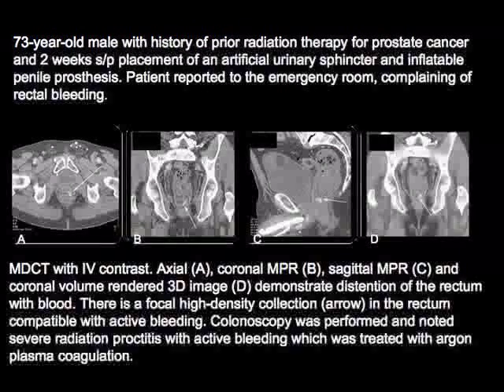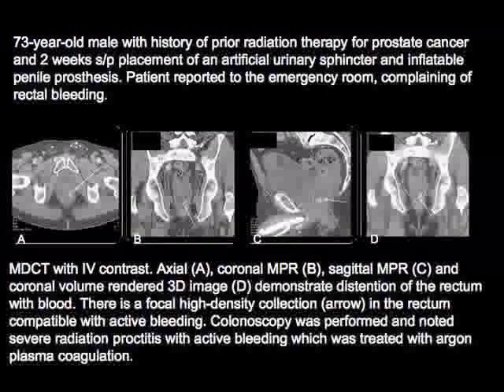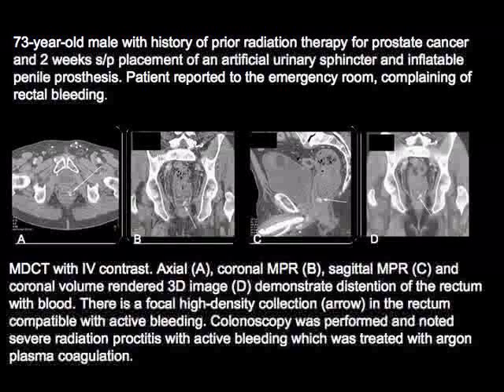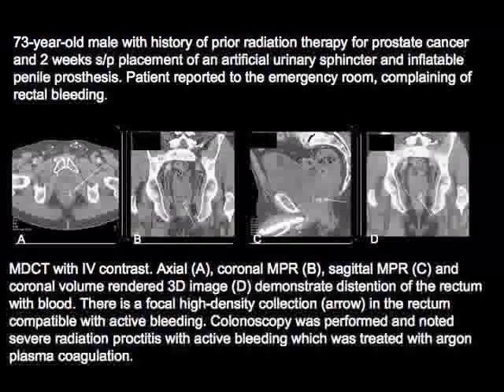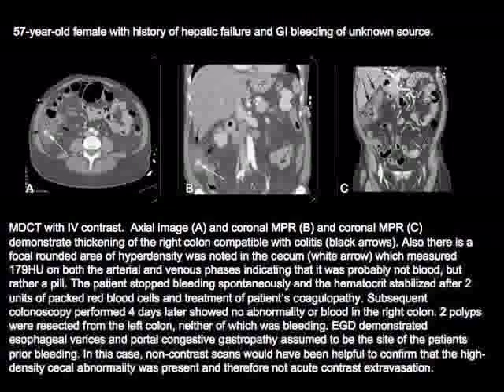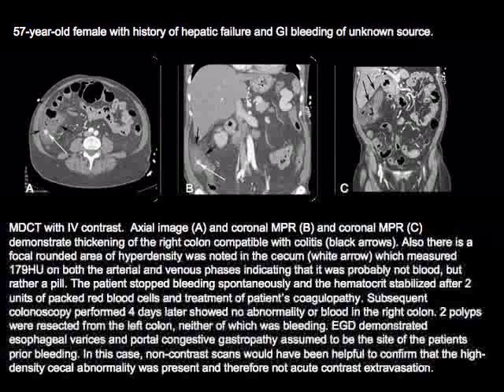Here are some examples. A 73-year-old male with prior radiation therapy for prostate cancer presents with rectal bleeding. On all views there is a high-attenuation focal lesion in the rectum — the site of active bleeding. Colonoscopy confirmed severe radiation proctitis, treated with argon plasma coagulation. Another case: a patient with hepatic failure and unknown GI bleeding. Looking at the cecum, there is a round high-density structure appearing to be active bleeding — but it does not change between sequences.